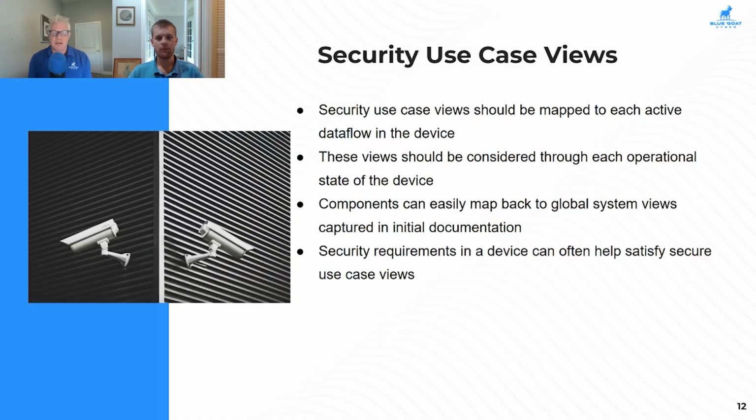We've been talking quite a bit about data flow. From your experience, our team's experience with device manufacturers and the developers of the device, do most of them actually understand the data flow of the device? So the manufacturers of the device do have, I would say for the most part, a fairly solid understanding of what it's doing from a functional perspective. But where the knowledge gap generally comes in is how security is going to be relevant. Understanding what a data flow is capable of.